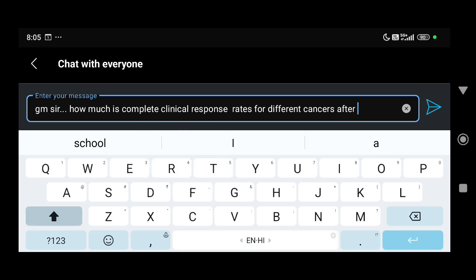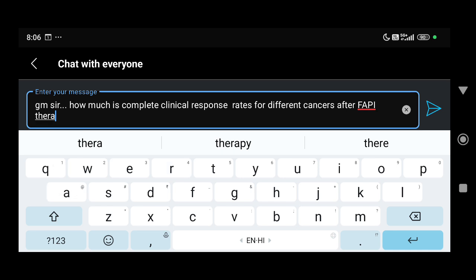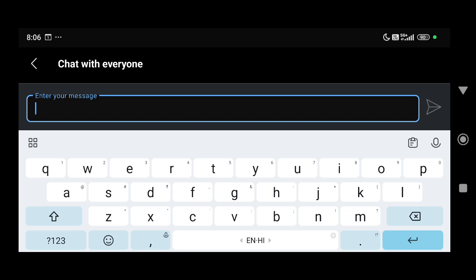In any oncological scans in our department, everything is FAPI except where we can't do FAPI. That is lymphoma cases; we don't do FAPI, as there is no good FAPI expression there. For head and neck tumors, lung cancer, breast cancer, ovarian cancers, GIT cancers, we directly do FAPI. Even the FAPI PET CT scan, we do at 8 o'clock in the evening, night also. The same patient after the OPD, we do the PET CT scan with FAPI and we send them back.